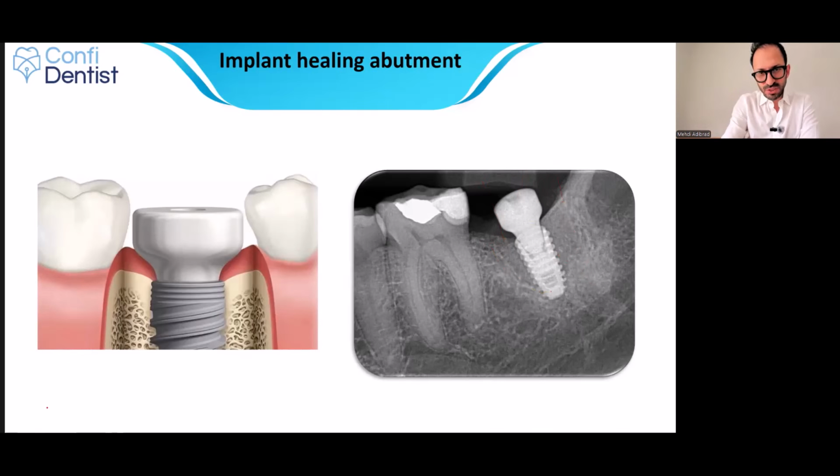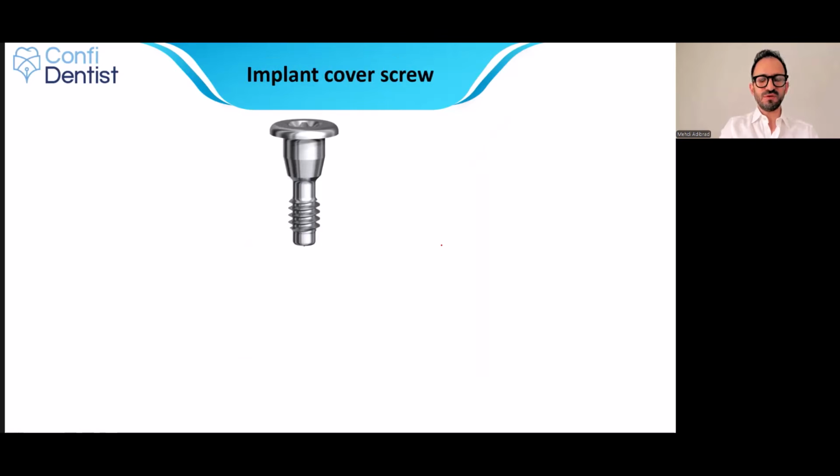Okay. Looking at the adjacencies, you can see some composite restoration, amalgam restoration. This patient obviously has some evidence of attrition. You can see the flat occlusal table, no evidence of caries, the external oblique ridge, and the nerve. They are also visible in this X-ray. Okay. And you can see some evidence of pulp recession. Okay, there are some important points for you guys to remember when you check an X-ray. Just pay attention to all the relevant information, especially for the ACJ exam.